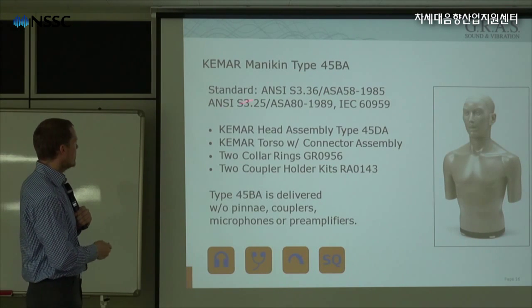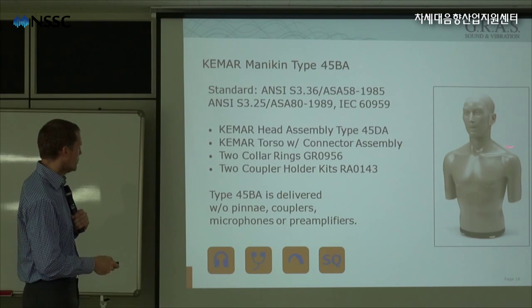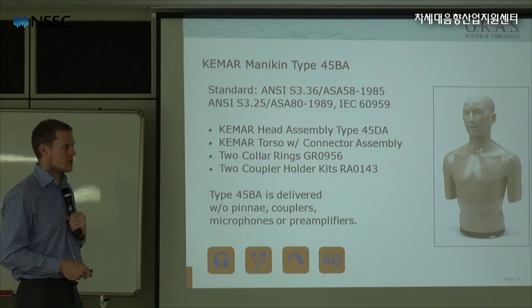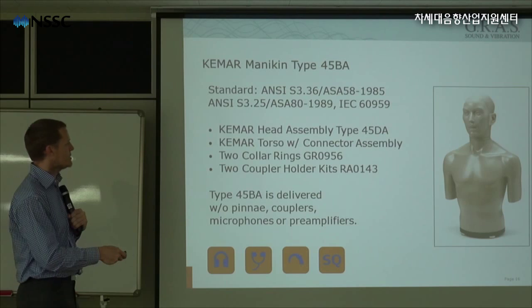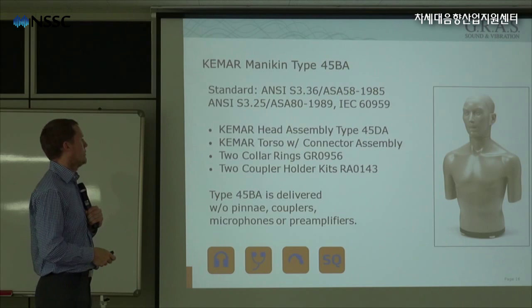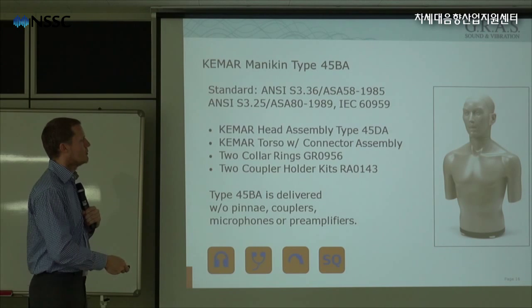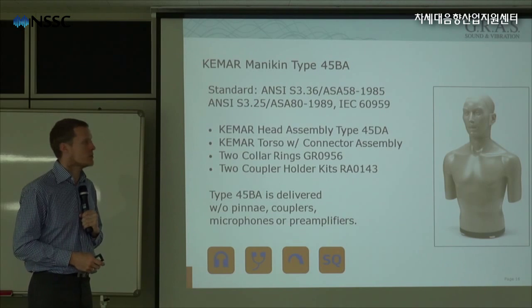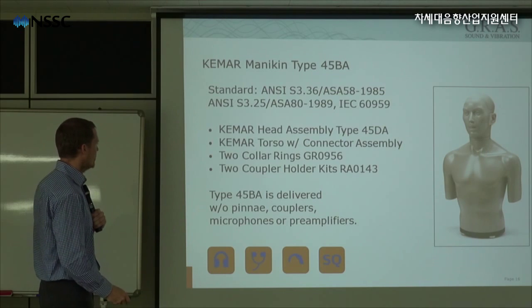So this mannequin is suitable for testing headphones, insert phones, hearing aids, and sound quality tests. Typically we have a full database of HRTFs of the KEMAR, the response at different angles, and we have a lot of historical data on this human mannequin. There are many articles written about the performance of the human mannequin KEMAR.